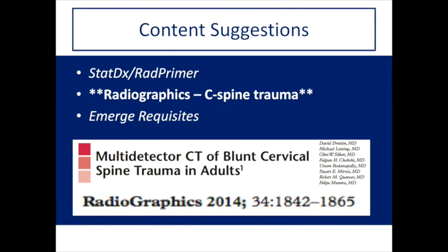What we will do is quickly mention the major categories of injuries and some key pearls. But this is in no way meant to replace reading about the different types of fractures, because we can only cover them superficially here and mention some pearls.